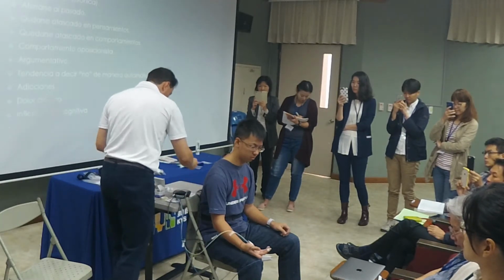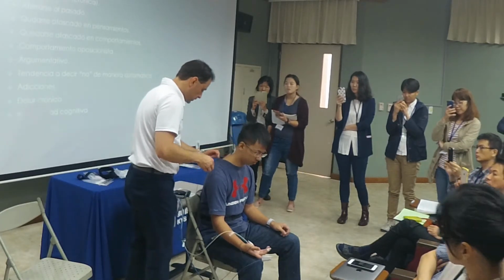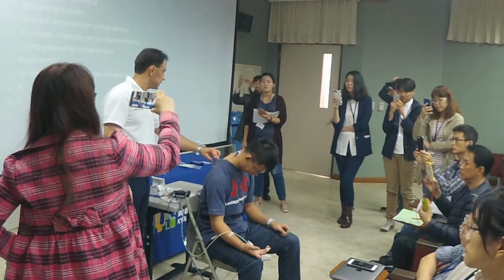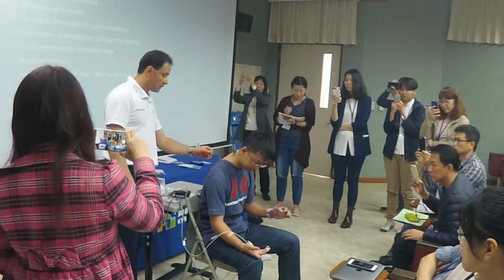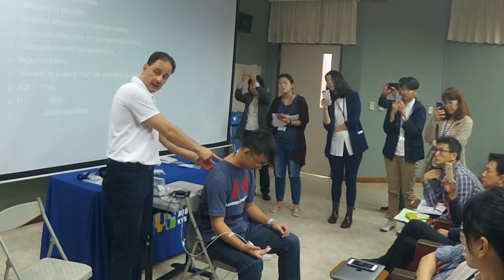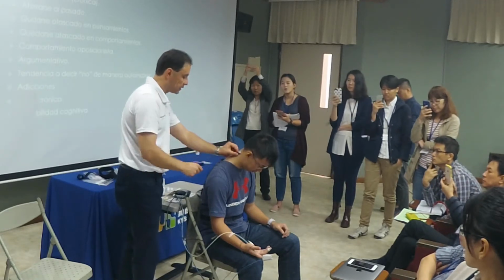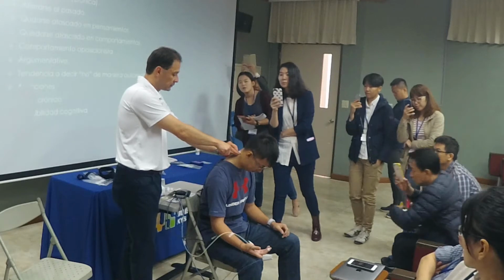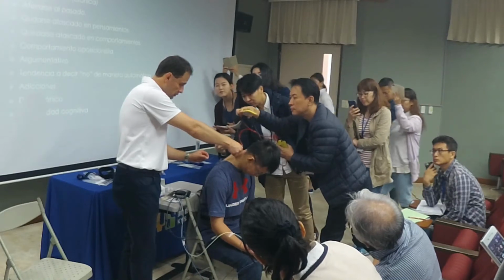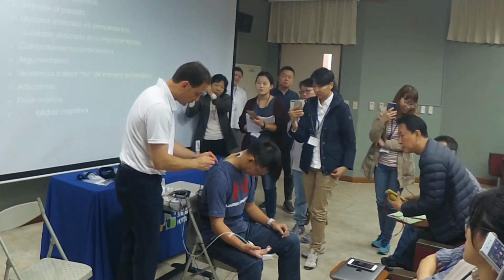And then you put one more sensor in between the active ones. So where you put it, you go back to the shoulders and go in between the neck, in between the shoulders, and there it goes. Now, make sure that you see how the cable is bending here. So what you do, you bring it down and problem solved. Because if you do it like this, then you're going to have the problem with the bending. See the bending at the ending? That's going to ruin your cable very soon. You're going to need to buy a new one. So you have to make sure you minimize the issue. And then you bring the clip, and I'm going to bring up your shirt a little bit.